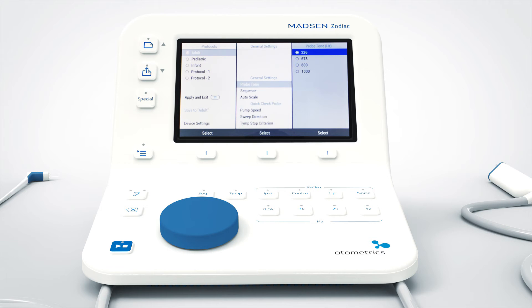If you have the quick check version of Zodiac, you will not have the wheel. Instead you navigate with these two buttons marked with arrows. By pressing these buttons you navigate as with the wheel.